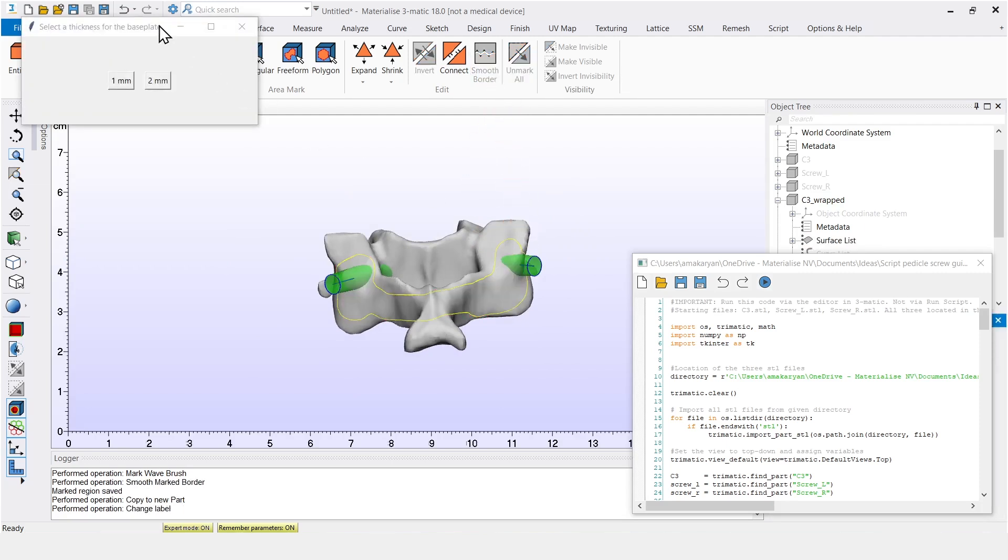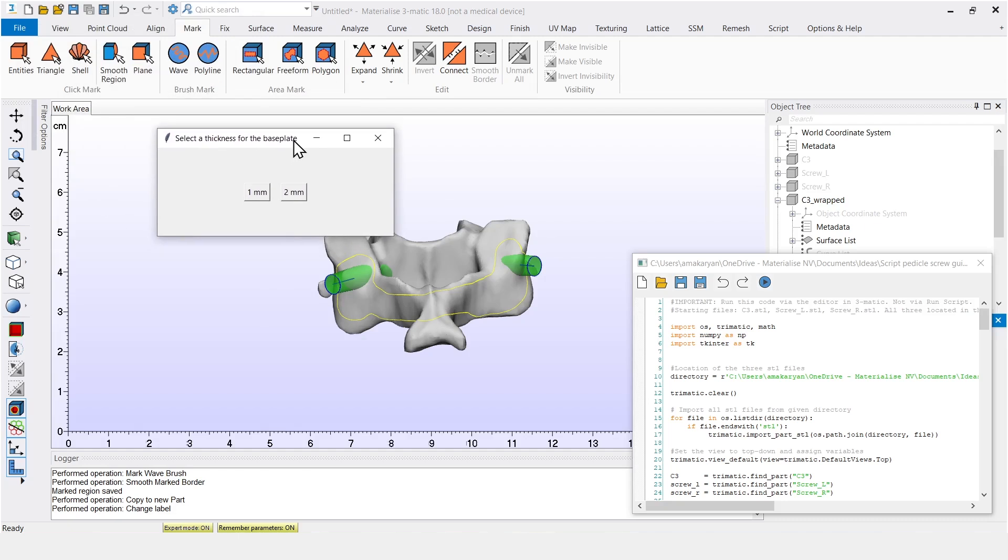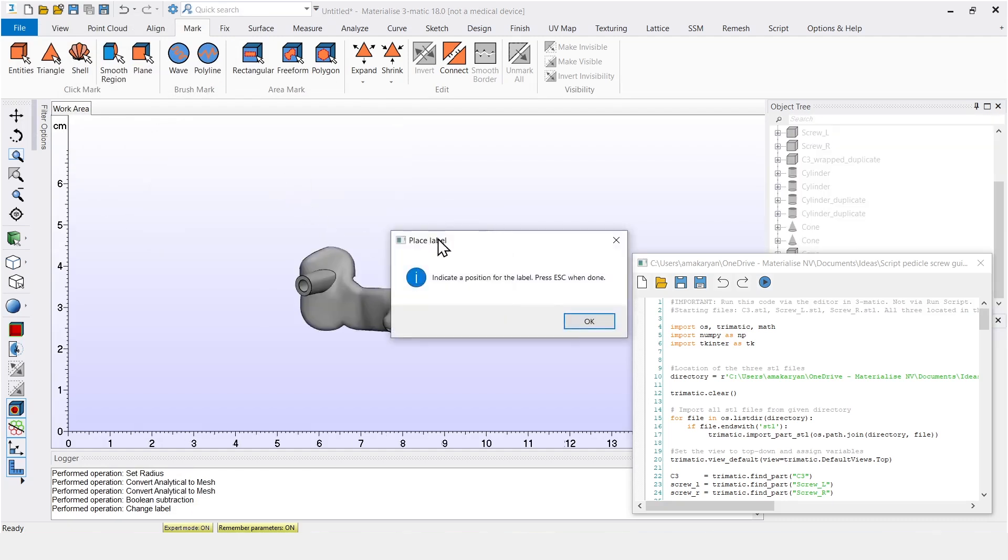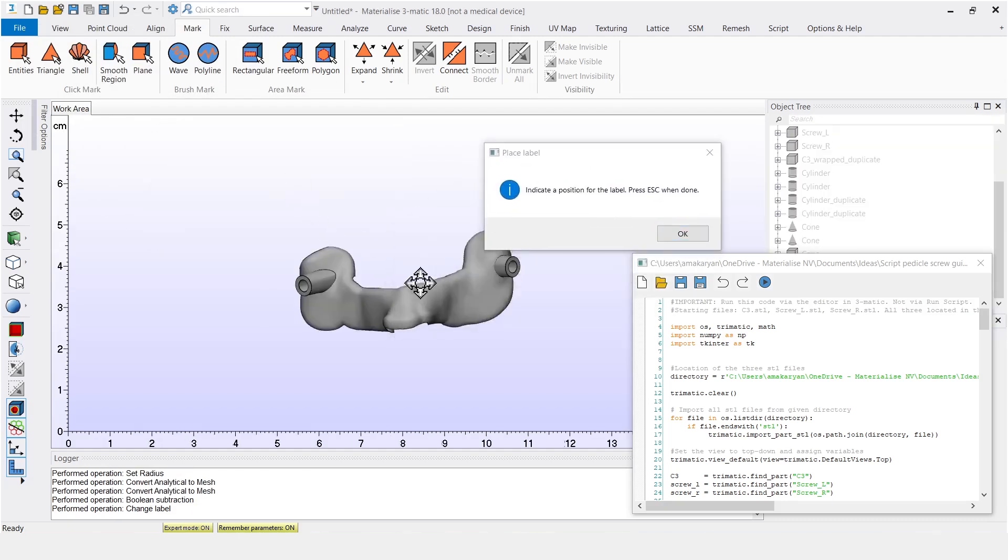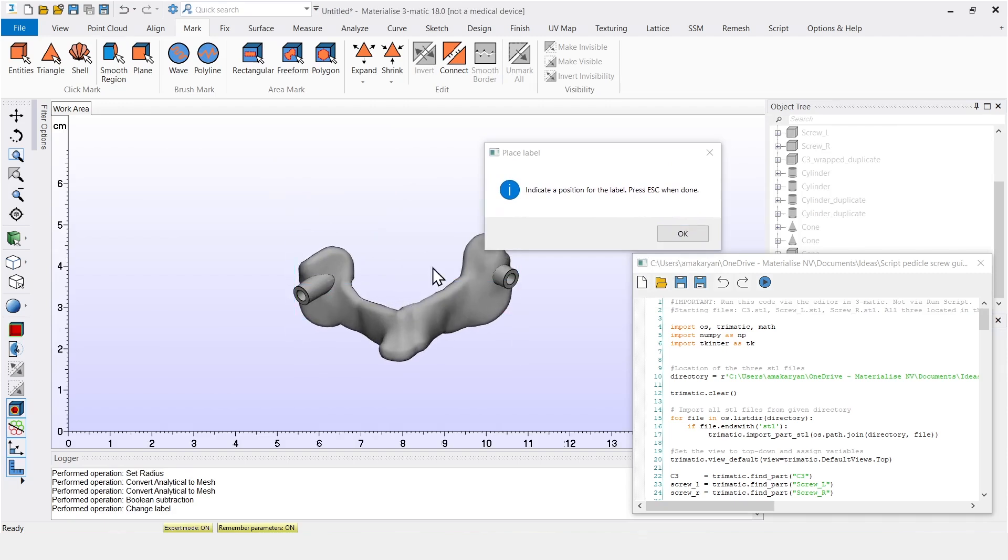Now a window pops up, asking to select the thickness for the guide. And let's go for 2mm here. After selecting the thickness, I can see the cones in the background are already added to the design, including the holes.